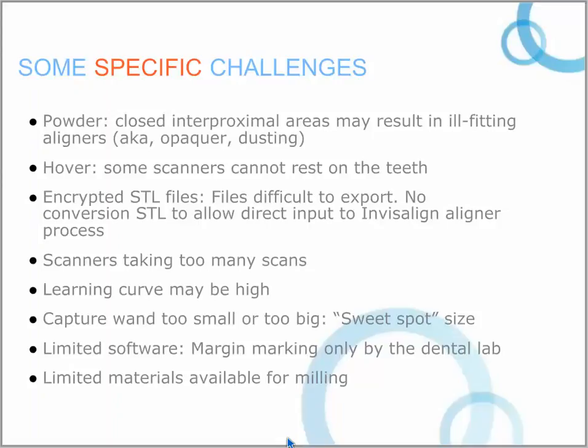Some systems have limited software, meaning that there are some things that you can't do. For example, margin marking can in some cases be done only by a lab. We'd again like for systems to include features that allow us to do the full gamut of things that we want for our restorative solutions. Often, in cases where milling is linked to, or there's a workflow with mills to different systems, one of the things to look out for is whether or not the milling materials themselves are limited. Now, just some things to think about, some challenges that we found with the different systems.